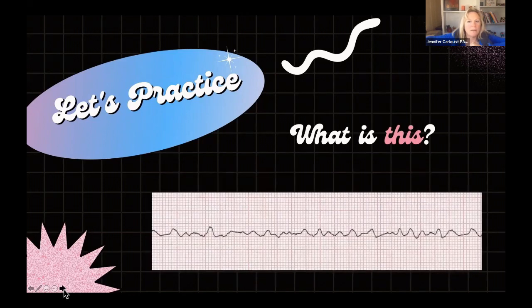So what is this? I think this is almost our final strip. This one's easy. Let's get some confidence boosted. This is Vfib. Okay, yeah, we're definitely not going to miss Vfib.